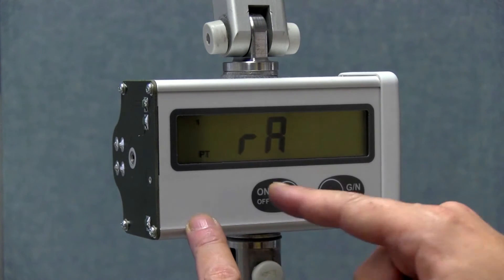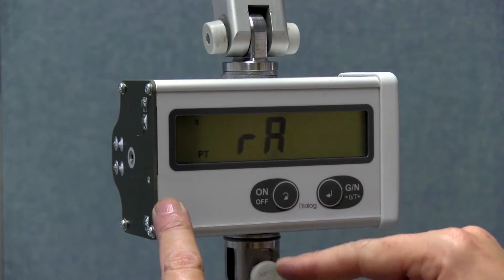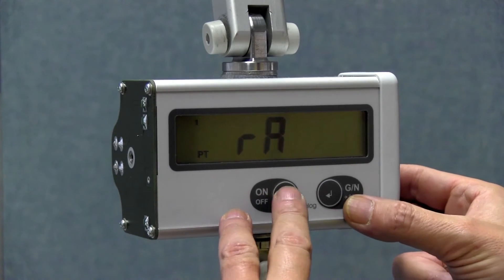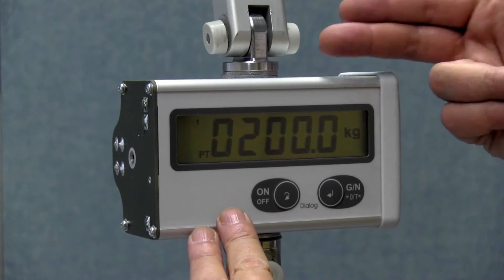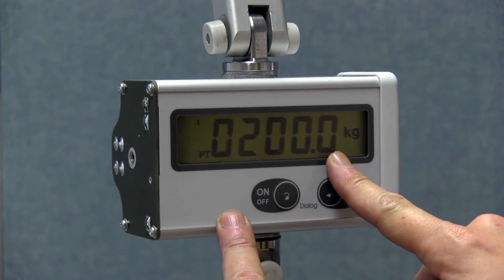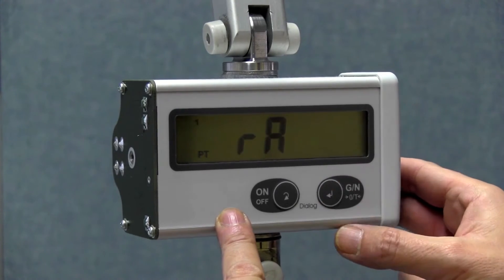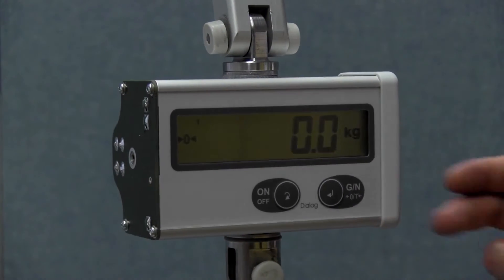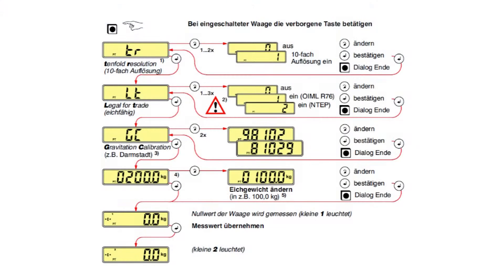The next key I press takes me to the range setting of the scale, a one range or two range scale. In this case, I see that I am working with a two range scale, and that the changeover point is at 200 kilograms. I confirm the changeover point, and by pressing the hidden key again, it takes me back to the normal weighing range.